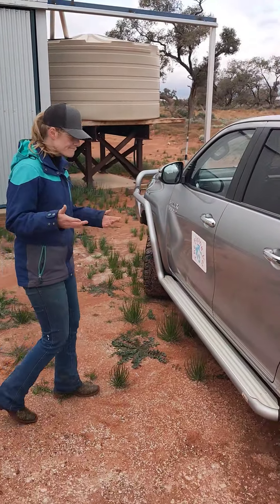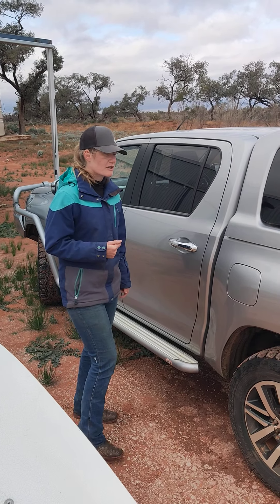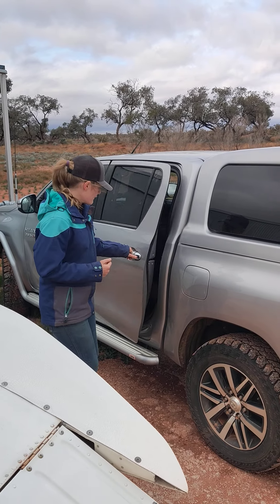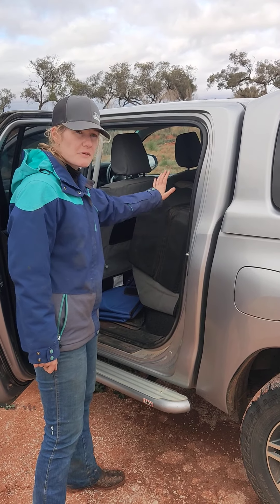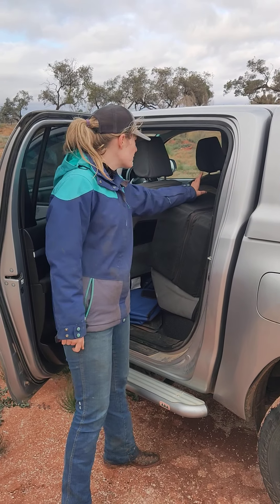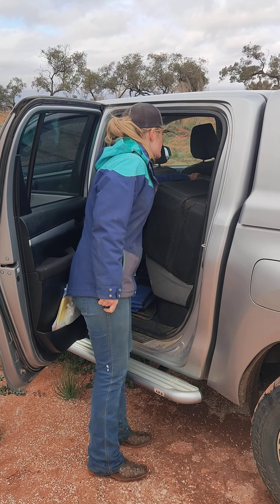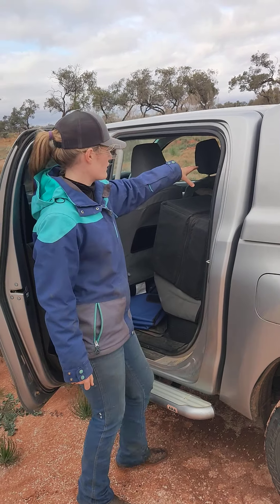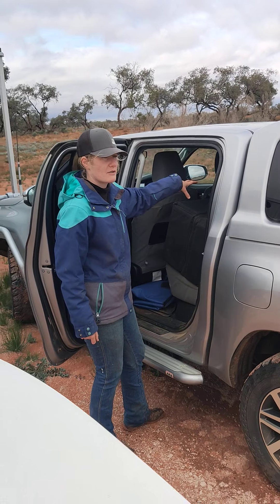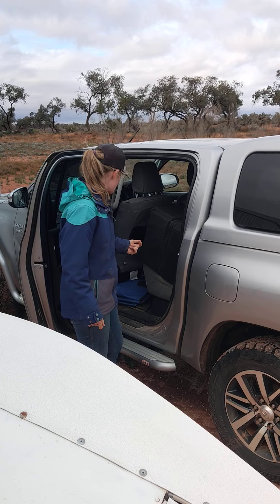I'd also like to take you through my car and what we've got at this moment. Nothing overly flash — it's a Hilux with a canopy on it. I've got my X-ray unit in here: that's my X-ray processor, my X-ray laptop, and also the X-ray unit itself. And further over is my oxygen generator for my anaesthetic machine, and also oxygen for emergency situations.